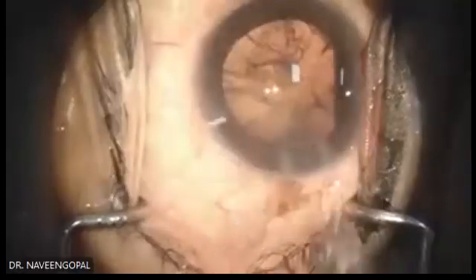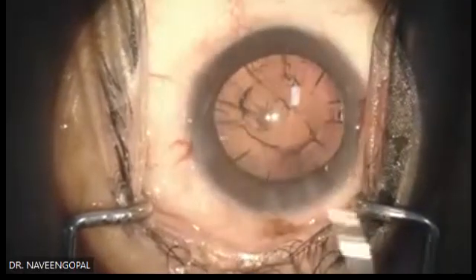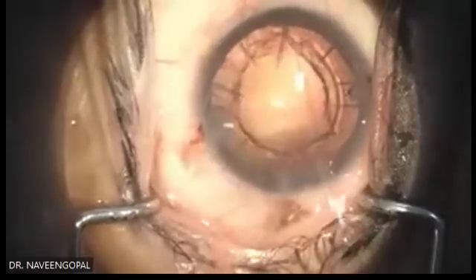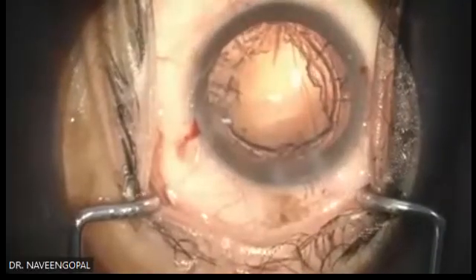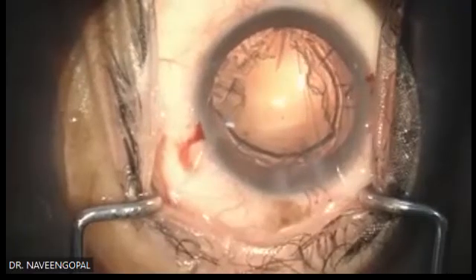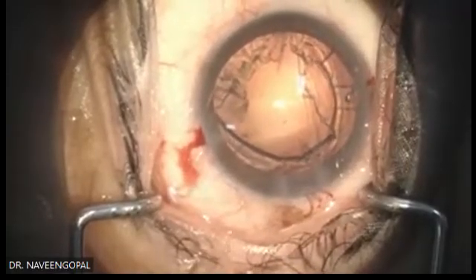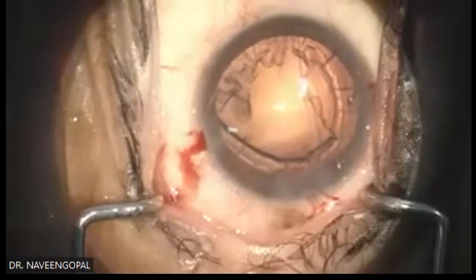We're done with the phaco. Next is cortex removal. If you are well versed with your phaco pedal, I can do even trenching in this 550 vacuum. It's okay. I've trained myself to calibrate and control the vacuum power, whatever I need, through foot pedal control.